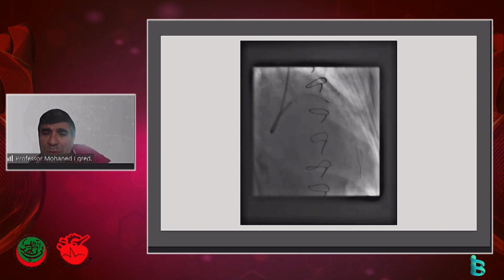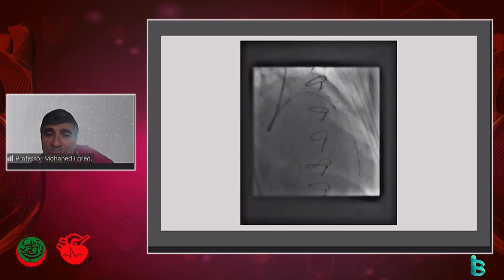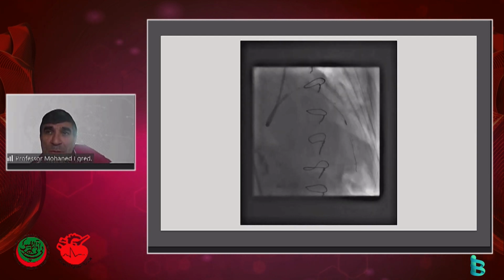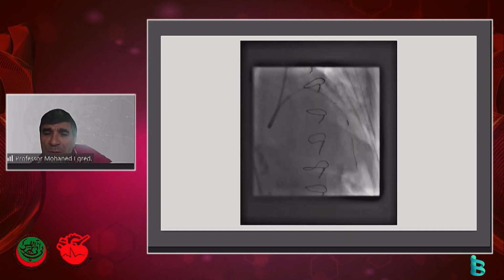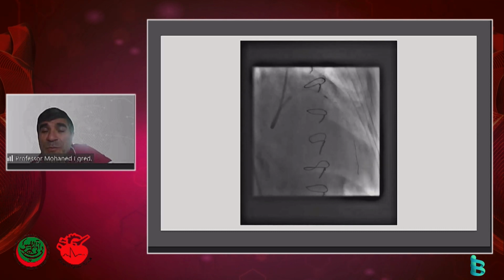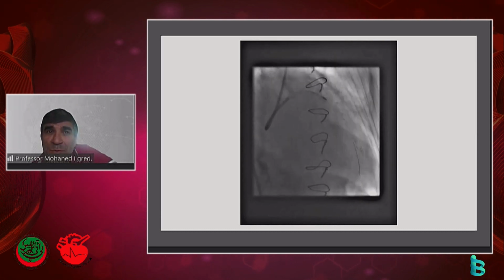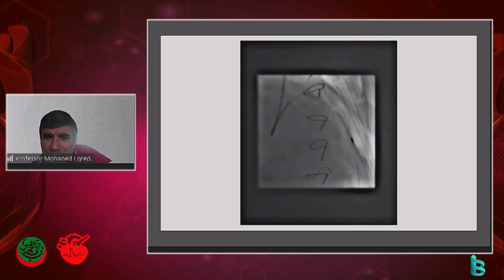In this case, I used a floppy wire, and you could use the 1.5, but you'll spend a longer time trying to burr, and the heat will be more, and the no-flow could be more. It's better to start with a smaller burr with severe narrowing and severe lesion, and then upgrade. And this is exactly what we did in here. The 1.5 will go eventually, but you'll have to spend much longer time, and you could cause more problems. So this was 1.25, and then I upgraded to 1.75, because the artery is big, and you could see now it went without any issue.